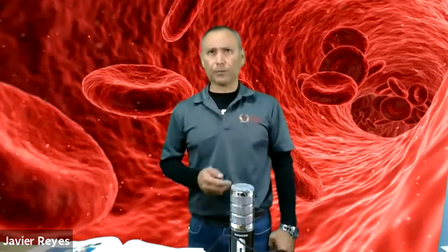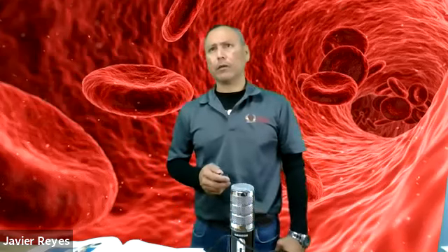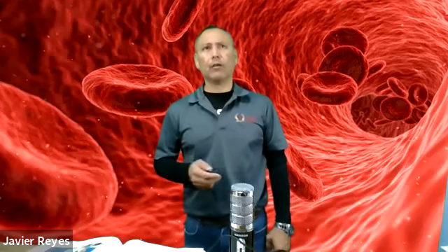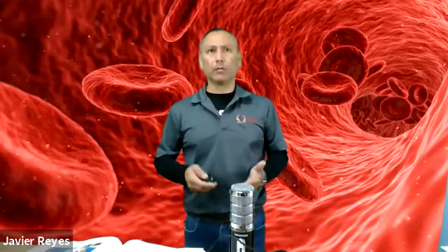So you see the colors in picture A. The capillary specimen collection is useful for pediatrics. Remember that we're going to be talking about the different amounts of blood that you can collect from newborns, from pediatric patients, and even adults. There are certain amounts of blood that you can collect at once, and it's very, very important for you to remember that. You don't want to exsanguinate someone or cause complications for the patient because you drew too much blood.